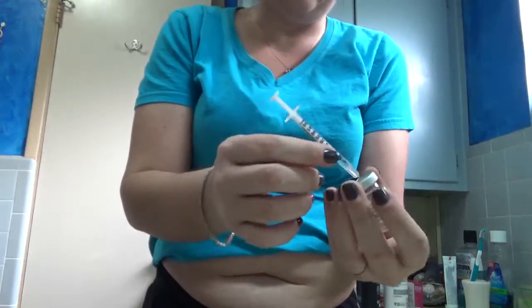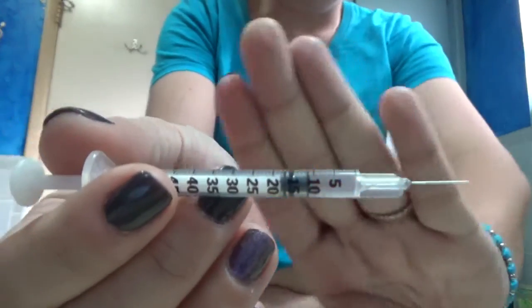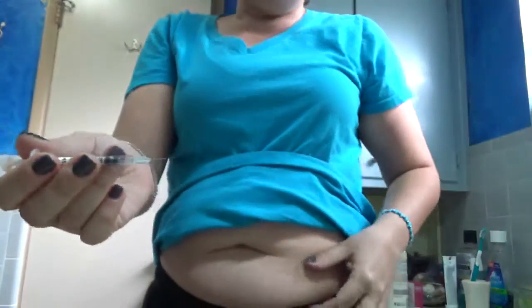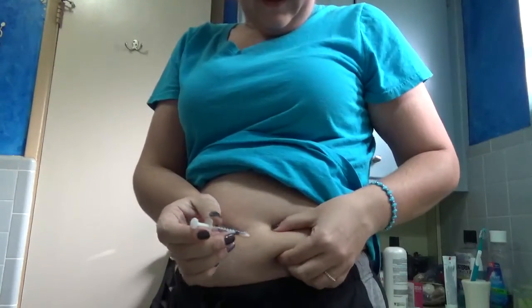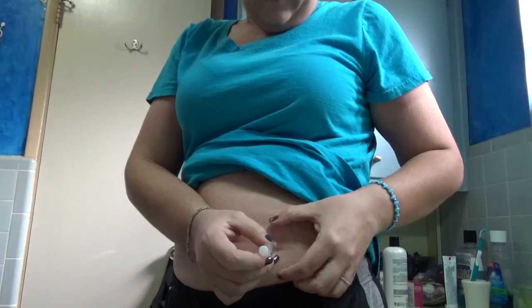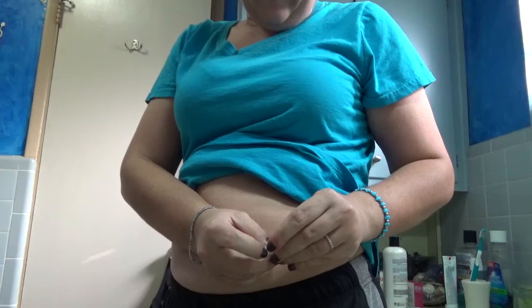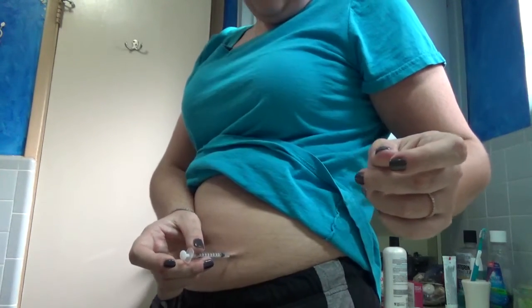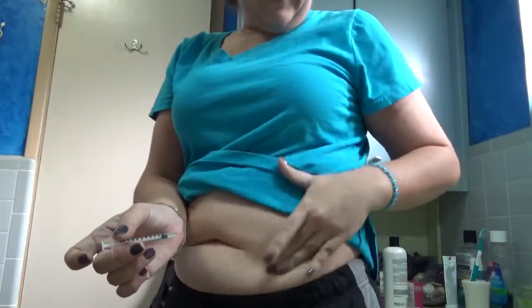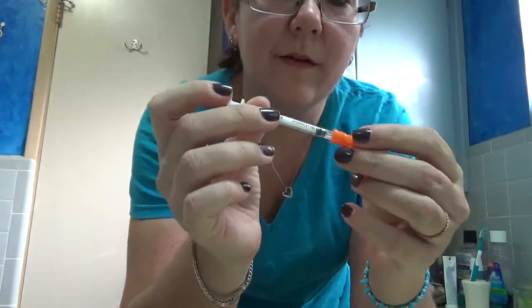I don't like the needle that came extra because they're kind of not smooth. So there you have it — 10 units. I pinch the skin, inject the needle, release the skin, and push in 10 units slowly. I really hate this needle because it is so hard to push the plunger in. I count to five as I push, then remove it. I always check for blood and massage the area just so it spreads around a little bit. I'm done with that. I recap the needle, tap it, and put it in my sharps container right behind here. All the trash goes in a regular trash can.